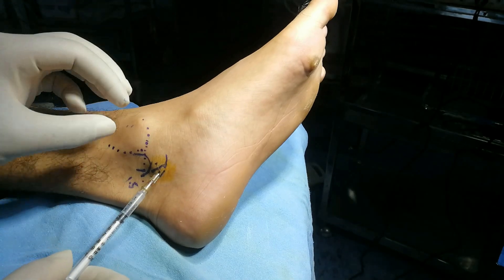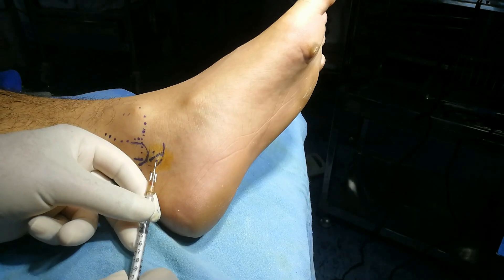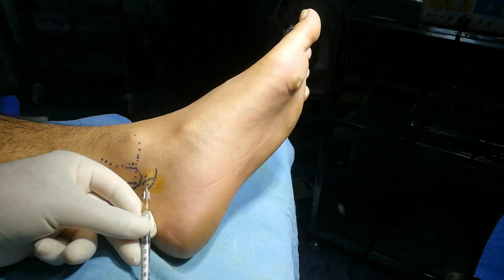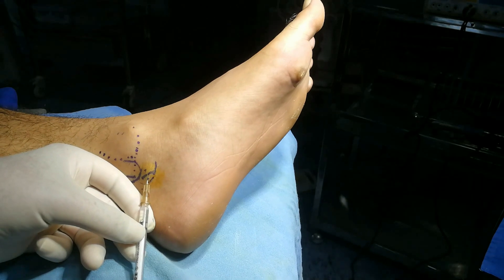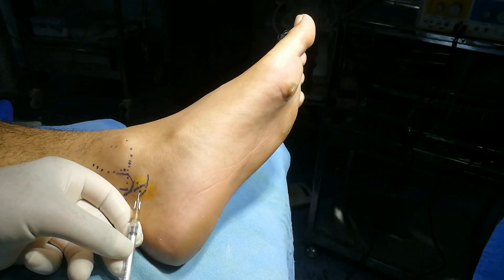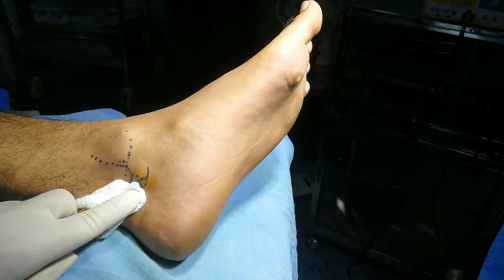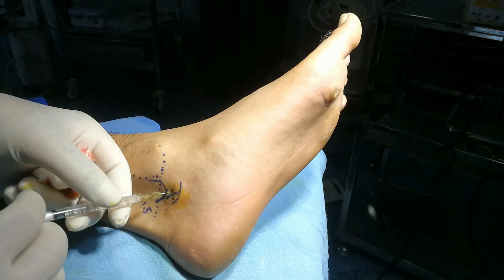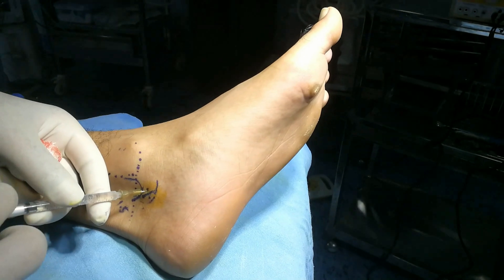Withdraw the needle and go superficially, lift it up and then anesthetize the other puncture point. I have injected 1 ml of lignocaine — there won't be any pain. Insert the needle. No blood.